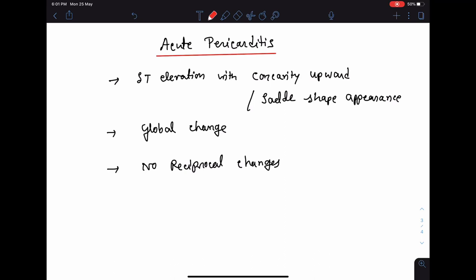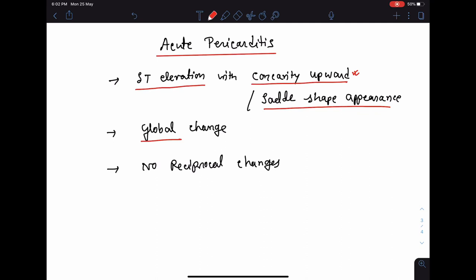Acute pericarditis can be a differential diagnosis of myocardial infarction because there is also ST elevation in acute pericarditis. However, in acute pericarditis the ST elevation has concavity upwards or a saddle shape, whereas in myocardial infarction the ST elevation has convexity upwards. Furthermore, ST elevation in acute pericarditis is global — present in almost all leads — and very importantly there are no reciprocal changes, whereas in myocardial infarction we will see reciprocal changes in other leads.